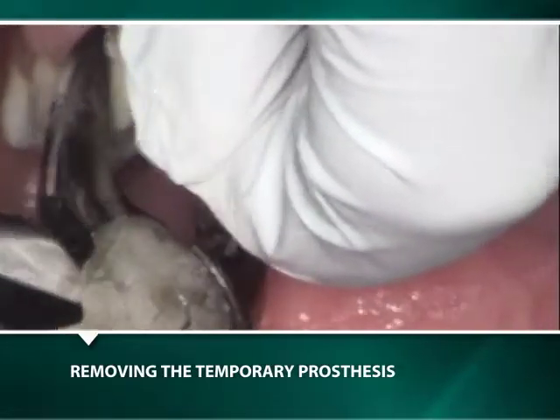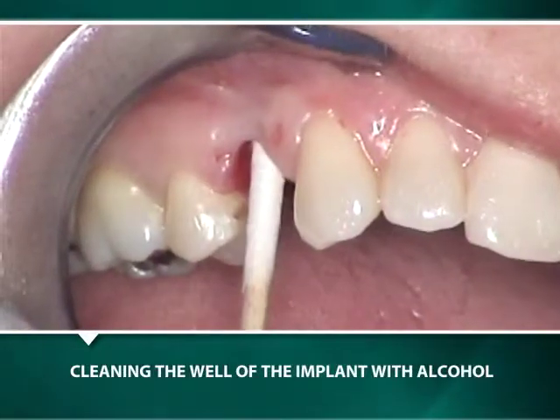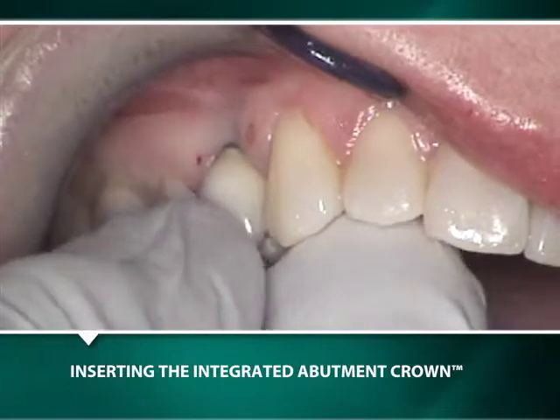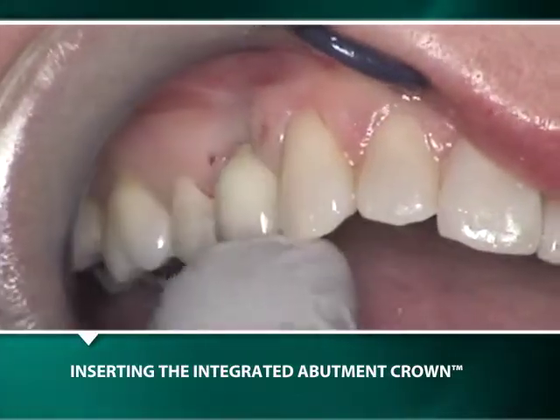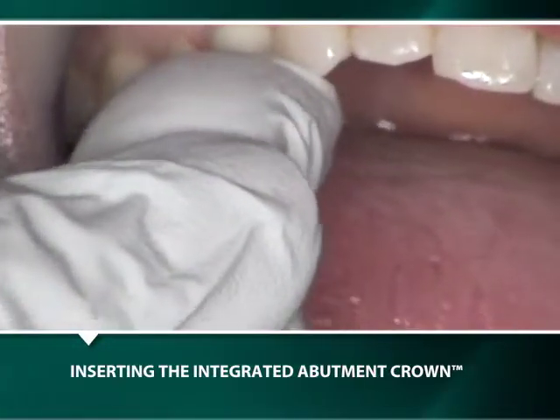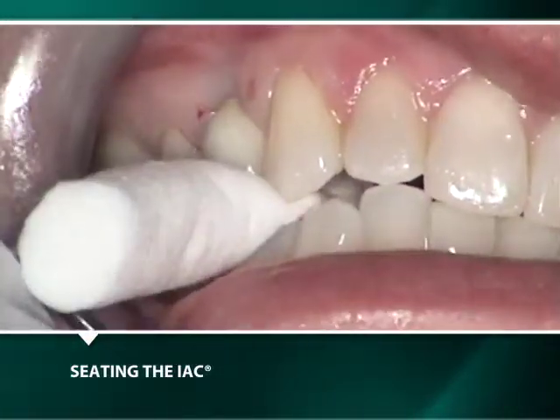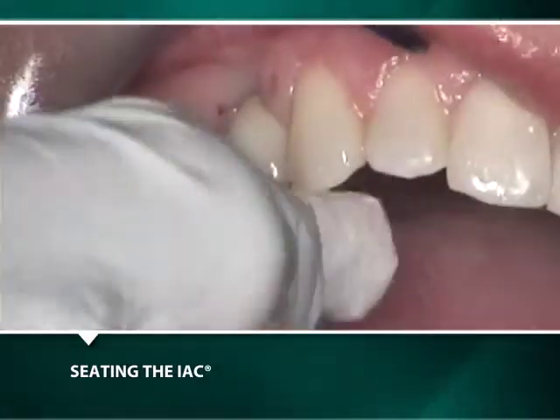During the third clinical visit, the transitional crown with its abutment is removed and replaced with a permanent integrated abutment crown. Definitive seating of the IAC is achieved by having the patient apply occlusal pressure by closing on a cotton roll.